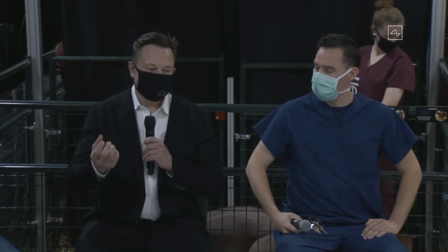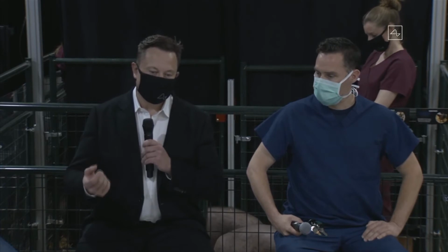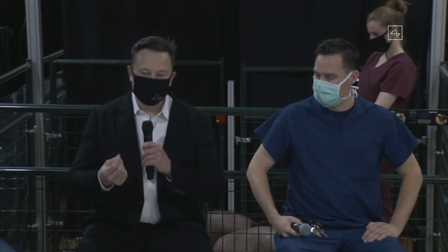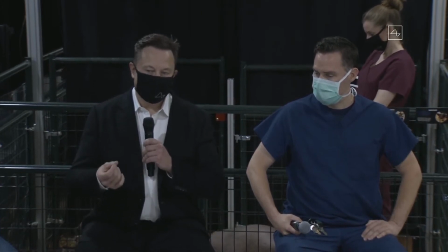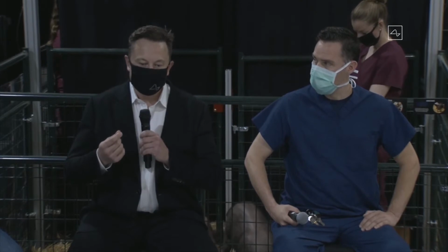And I think something that's very exciting as a long-term application is if you can sense what somebody's trying to do with their limbs, then you can do a second implant at the base of the spine or wherever, just after wherever the spinal injury occurred, and you can create a neural shunt. So I'm confident that long-term it will be possible to restore somebody's full body motion. So if somebody even has a severed spine, they will be able to walk again. They will be able to use their hands. When you have a severed spinal cord, you essentially have broken wires. And so if you can just jump over those wires and transmit the signals over those wires, you can give somebody the ability to walk again, naturally.